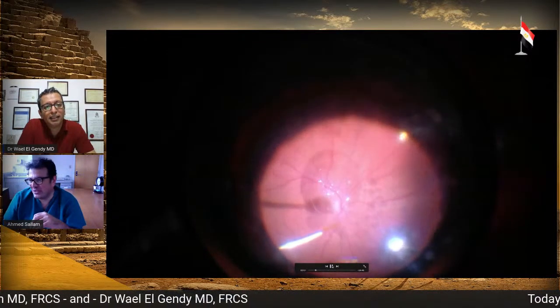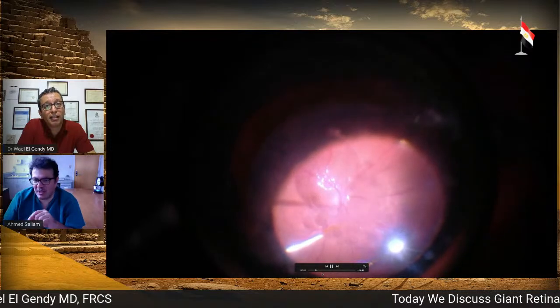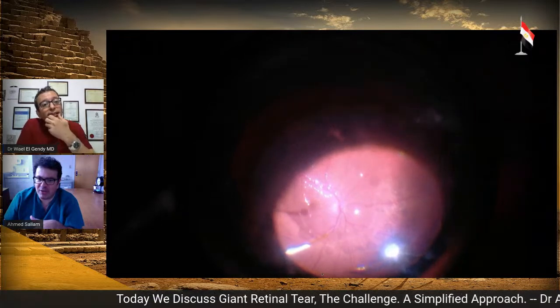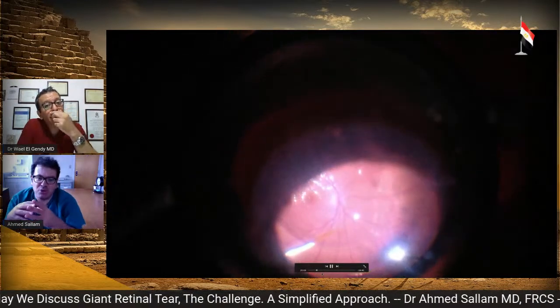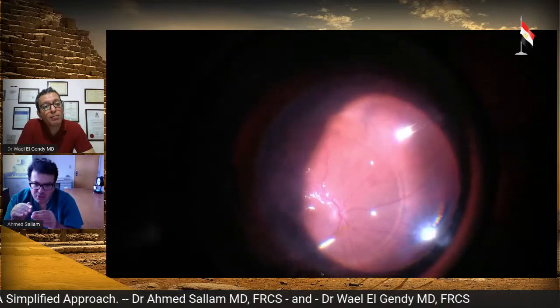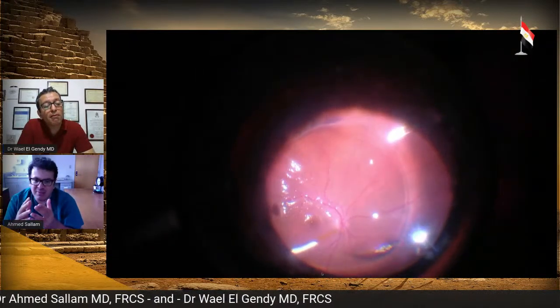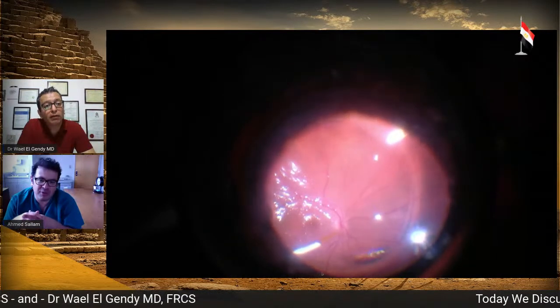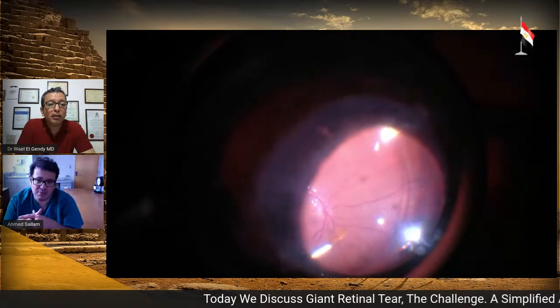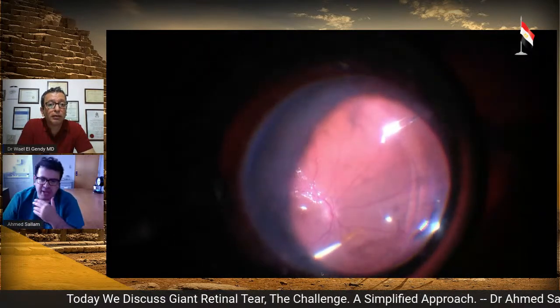Right. Okay, so here, this is actually in a way a bad technique because I have fish eggs, but initially it's fine to have that and they coalesce, but make sure you get a bubble and try to inject in the bubble. And if you have fish eggs, just touch them with the cannula and get them to coalesce. And I try to inject over the nerve and inject from a distance because the PFCL can go into the retina. And this is the dual bore cannula.